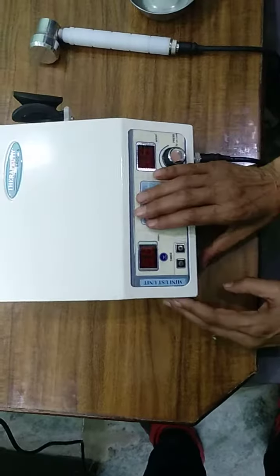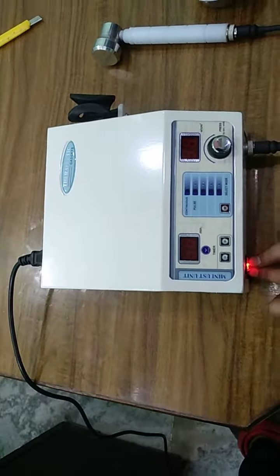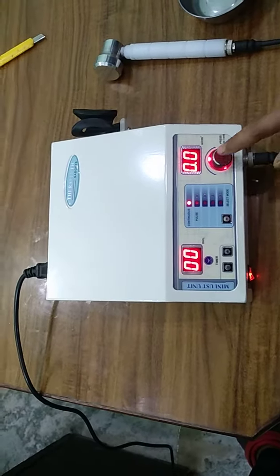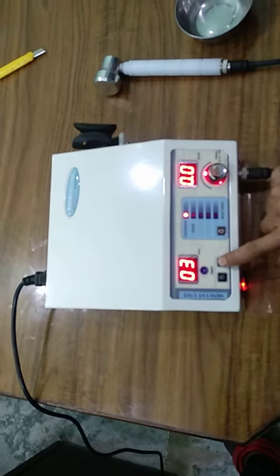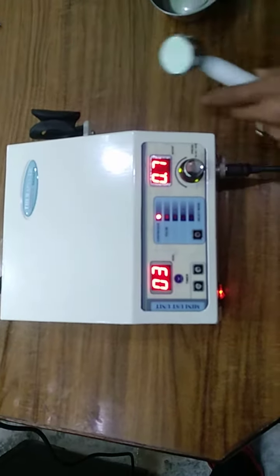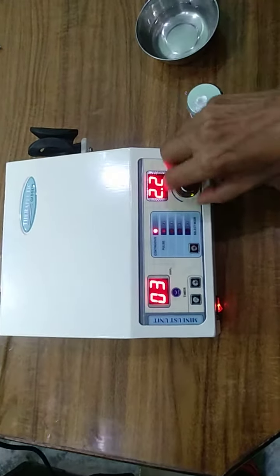This is a perfectly working unit. Switch on. If the light indicator is indicating, it means the fuse is working properly. Now press this button to set the time. Press again. You can increase or decrease the power. It means it is working perfectly.